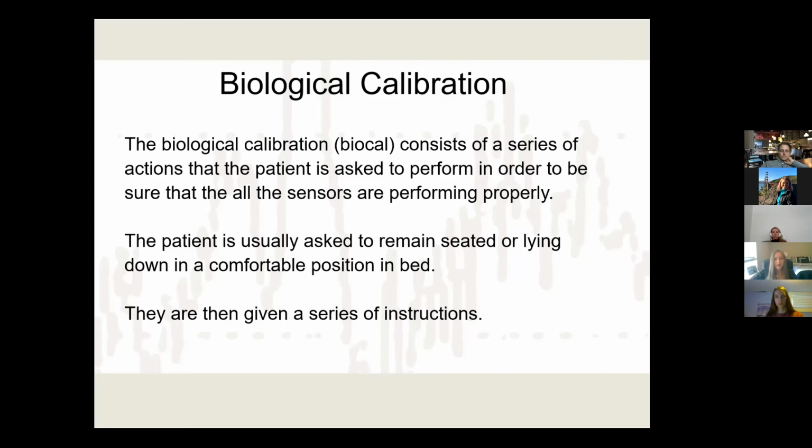Actually, you do them before MWTs as well. So those are the two times that we'll do BioCals for C2CM. The participant will either be seated in their bed or lying down if they're about to go to sleep. And then we give them a series of instructions, and this is where we will use our new intercom system. So they'll be in the room with the door closed, and you usually do BioCals through the intercom system.